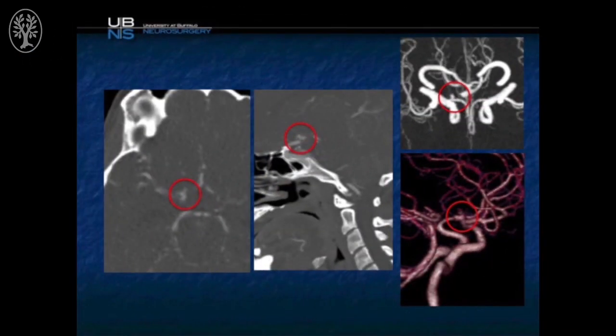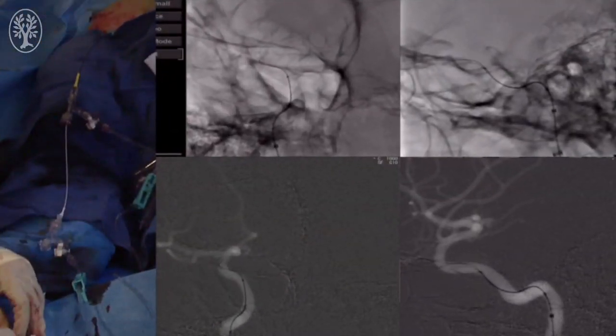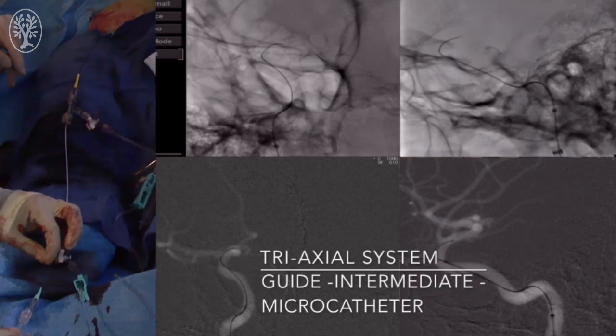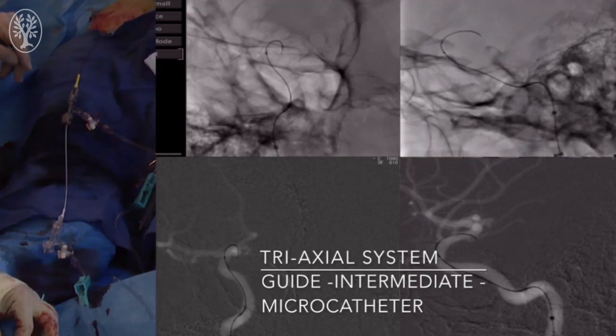The CT angiogram here confirms the presence of an irregular shaped dorsal carotid wall aneurysm. You can see from this aneurysm that it does have a favorable dome to neck ratio, but it is quite small. Here we'll use a triaxial system in order to have better stability, given the fact that this is a small aneurysm and it is a ruptured aneurysm.